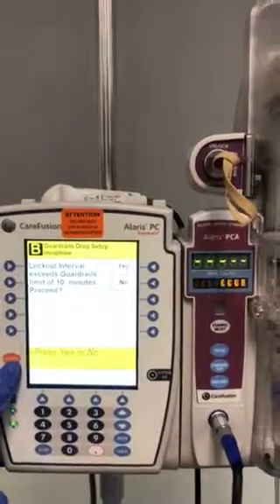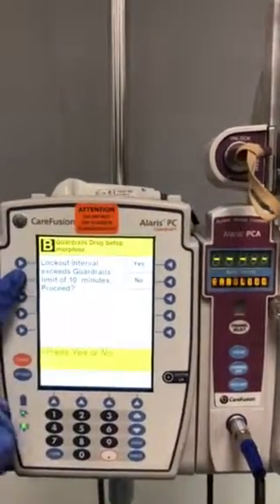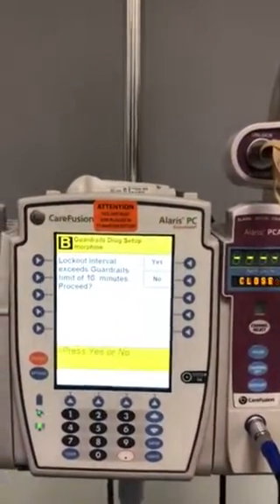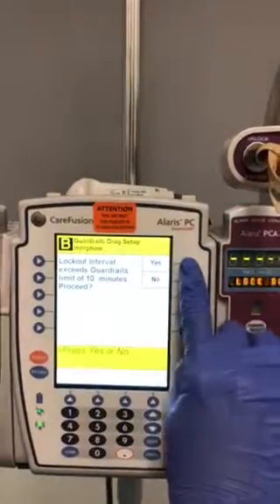You may see a screen that says your lockout interval exceeds the guardrails limit of 10 minutes. Do you want to proceed? If this has been ordered, the answer is yes.